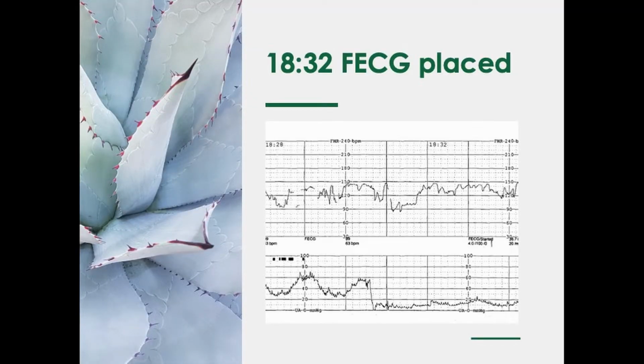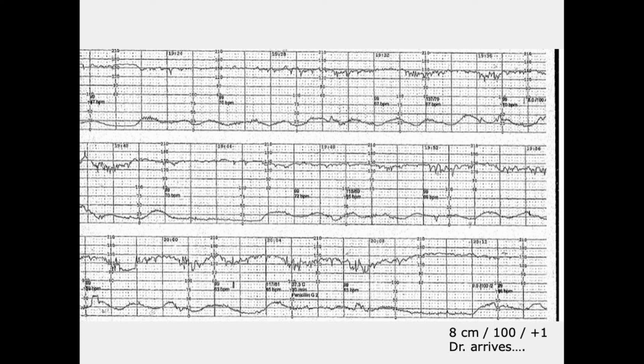Okay, so in this case, in response to that big sequence that I just showed you, a fetal scalp electrode was placed, as well as an internal pressure catheter. And we see kind of more of the same, okay? There's lots of decelerations in here. Can you guys comment on the variability from this overall pattern? Does it look like it's minimal, marked, moderate?